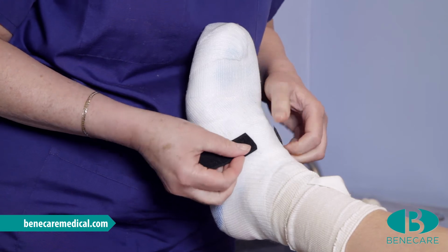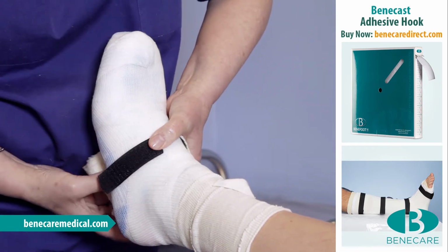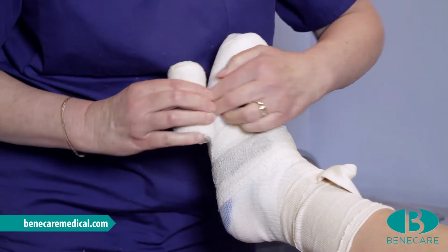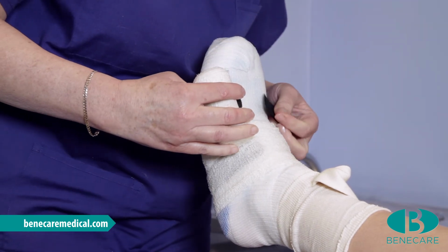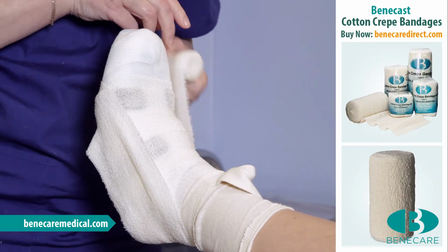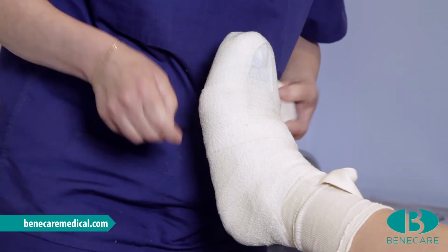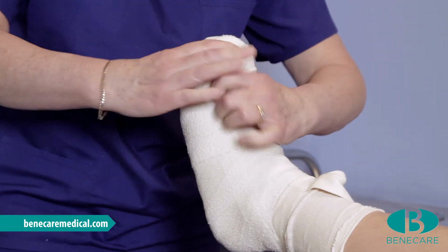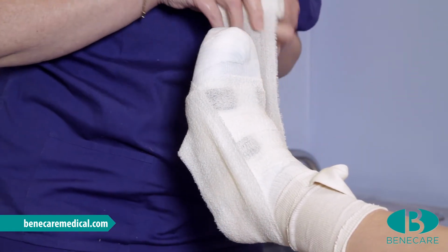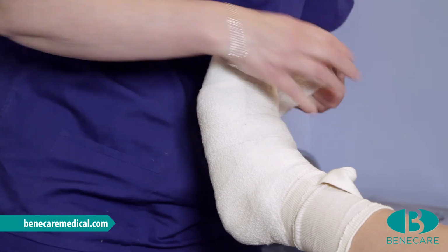Apply 4 pieces of adhesive hook and secure with a wet elasticated bandage. Then continue to wrap the bandage and cover the whole of the cast evenly. The bandage will hydrate the casting material, therefore activating the exothermic reaction. It will mould it to the contours of the limb and laminate the layers to make the cast strong.